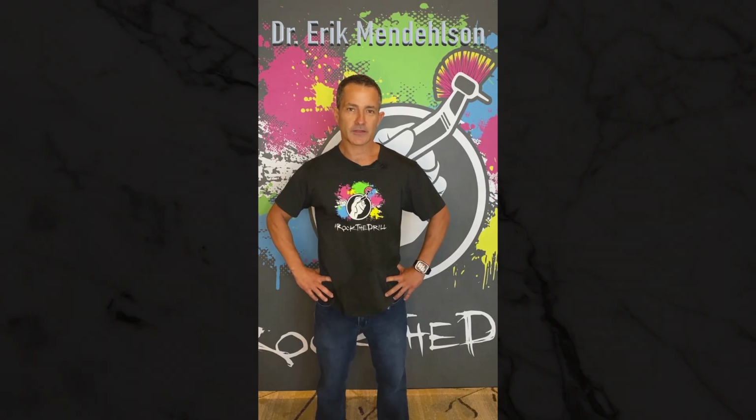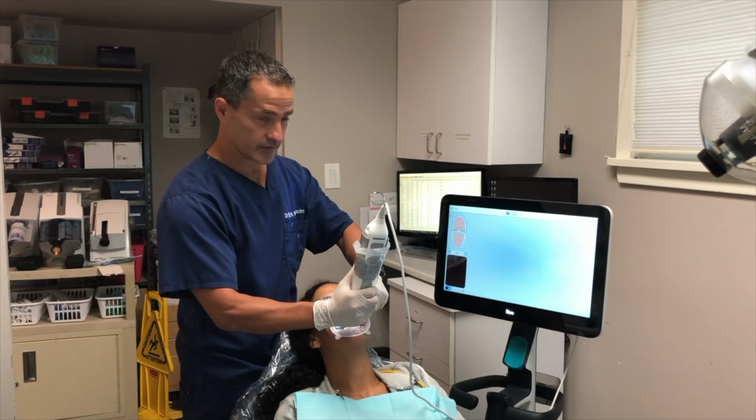So we're going to talk about digital scanning today, what to avoid and what not to avoid. I've been using scanners for a long time, so I've seen a lot of the mistakes happen over the years and where things were good and where they started to not work anymore. So the biggest thing is have a good scan pattern.